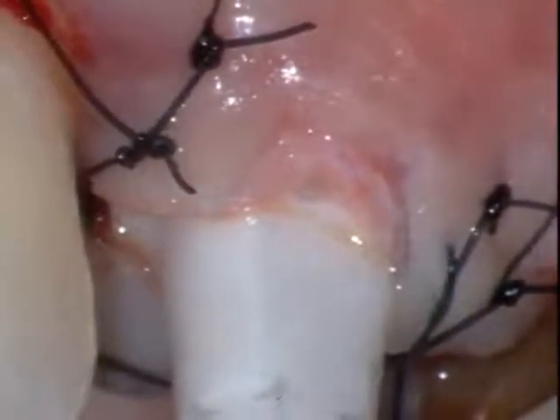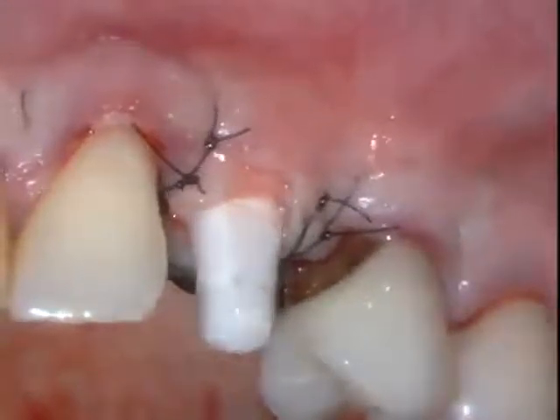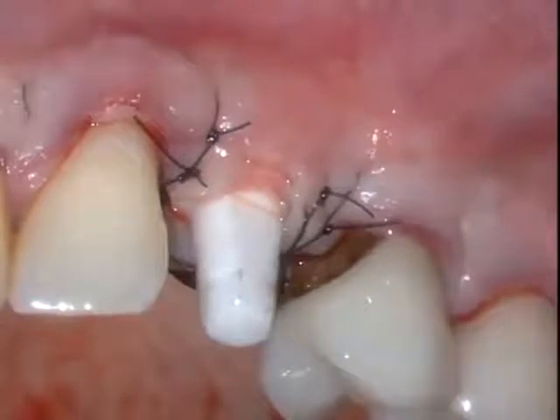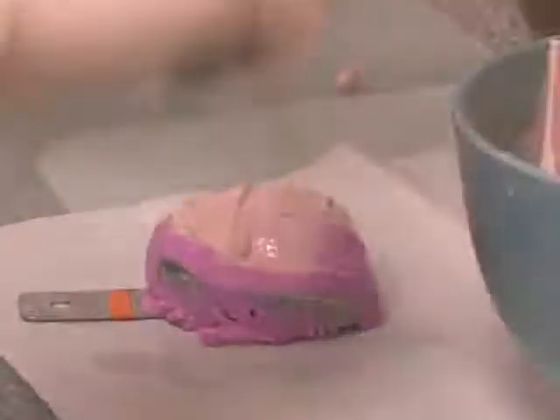Now we have a very nice adaptation on high magnification. You can see the nylon sutures in place and irrigation, the connective tissue graft, the adaptation of the connective tissue stabilized underneath the buccal flap on both the adjacent teeth and the implant site. On the x-ray, you can see a very, very good and precise fit of the implant to the surrounding bone.